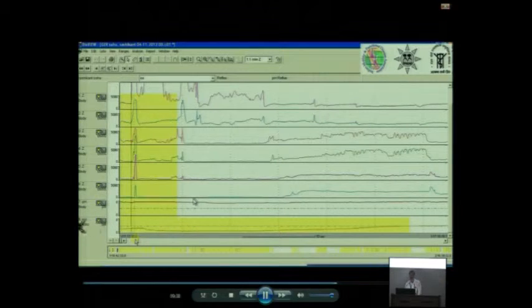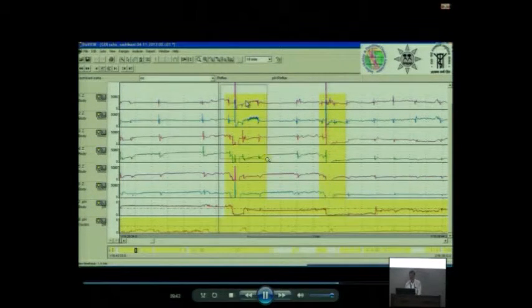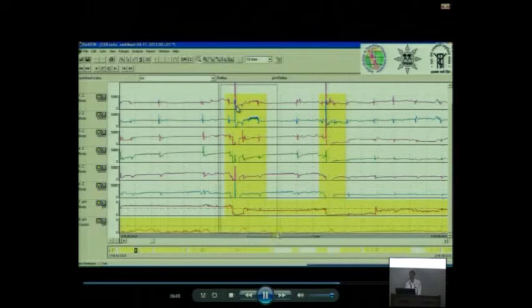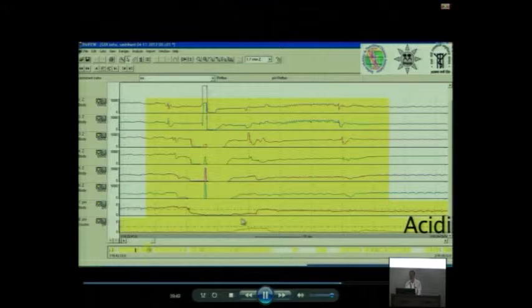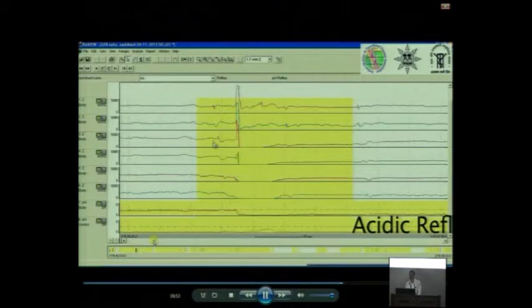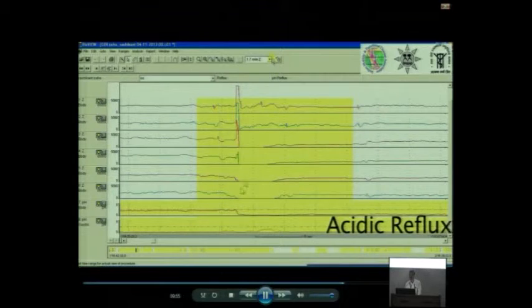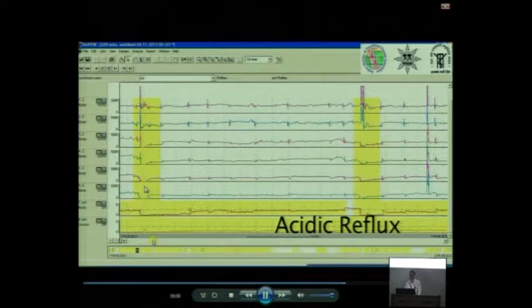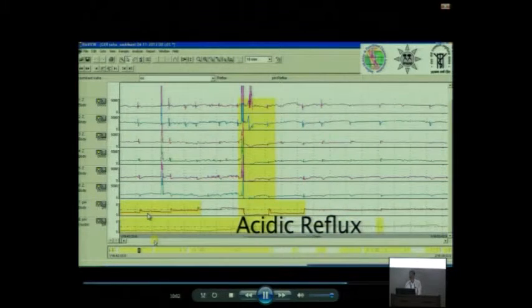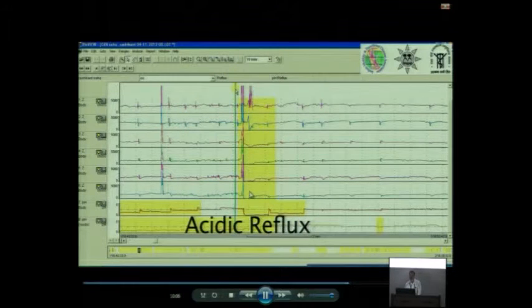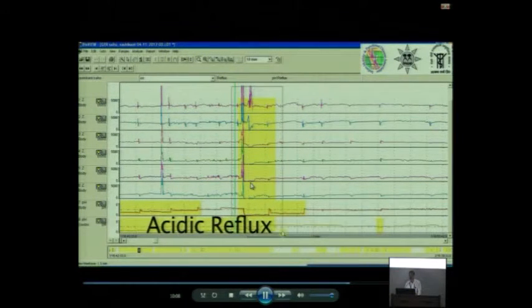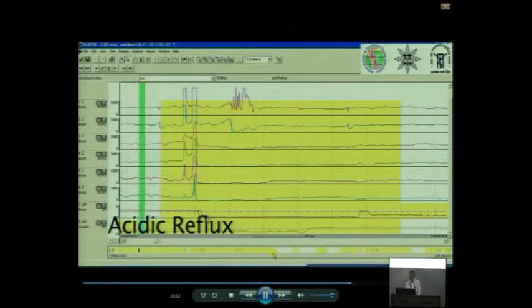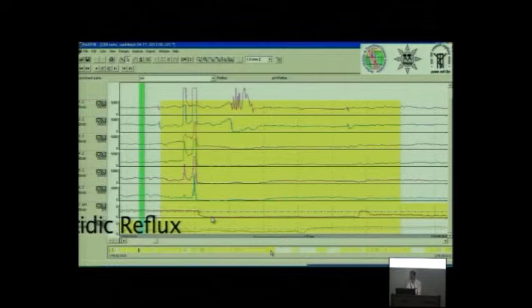Let us also show some acid reflux. This is again a gas reflux because impedance has gone. But look at this - the moment gas reflux has occurred, the patient has swallowed and the pH also has. This is typically a mixed reflux where both gas and the acid has been refluxed, because you can see following this increase in the impedance there is a lowering in the impedance and also pH has dropped. This is a gas reflux followed by an acid reflux. So this is a gas followed by a liquid reflux, and during the liquid reflux you can see there is a drop in pH. So this is an acidic liquid.